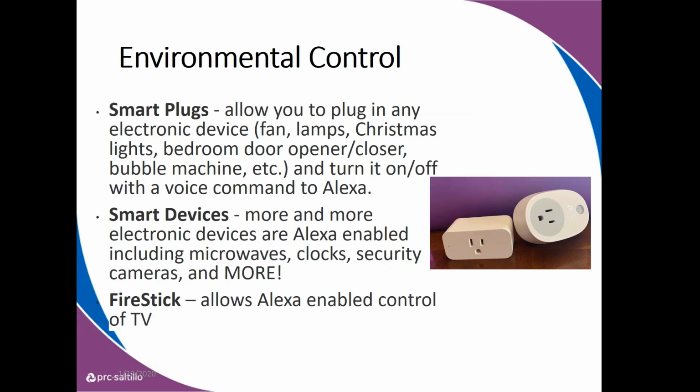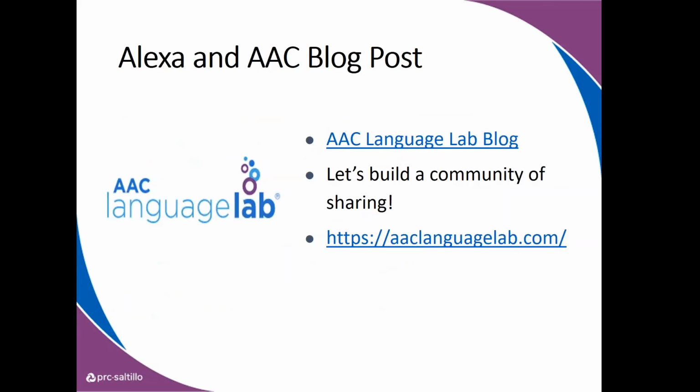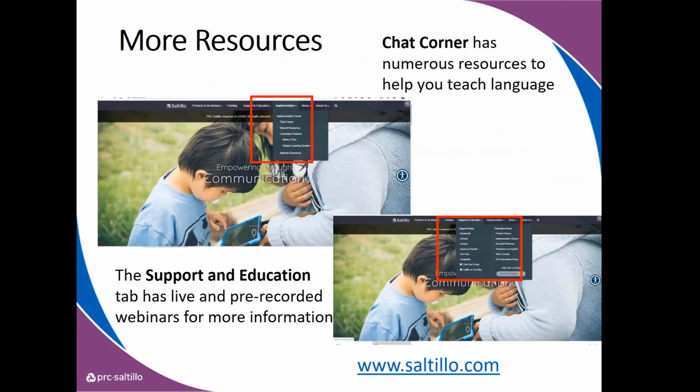All right. So if you want to learn a little bit more about Alexa and AAC, there's a blog post we posted a couple months back, I think, on the AAC Language Lab. There's lots of activities there too, but once again, you can use your device to support so many things, for independence, for academics, and for fun. And I hope you'll take a look. There are more ideas and supports in this little blog that you're welcome to take a peek at, and then just further ideas for using your AAC device.